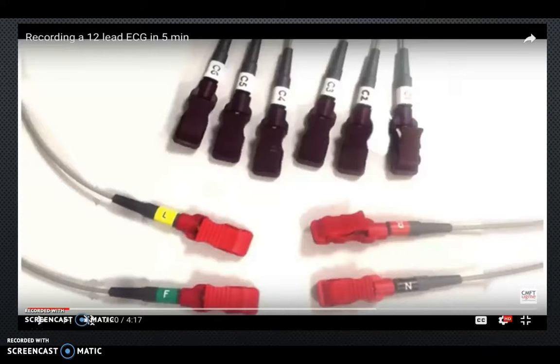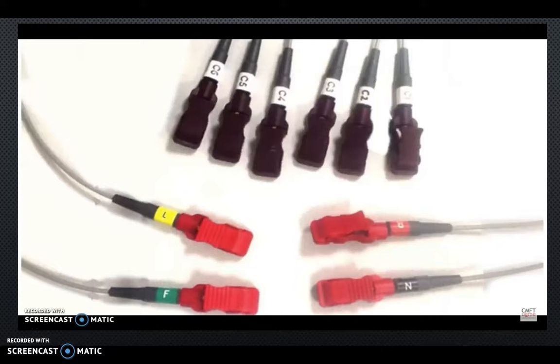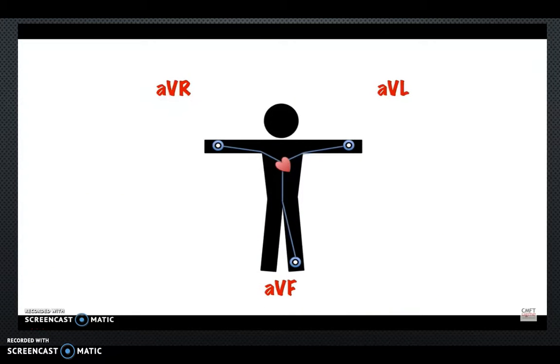Like Tim may have mentioned, an EKG has 10 wires, but is a 12-lead EKG. That 12-lead EKG is possible with those 10 wires because some of the wires connect their electrical activity through the body. The AVR, AVL, and AVF leads help to create that picture across the body.